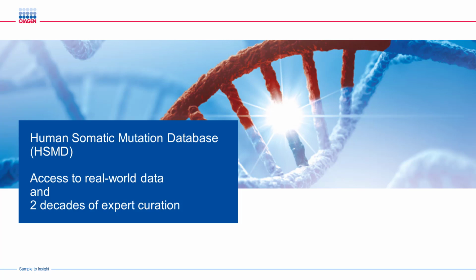Prior to joining QIAGEN, I was a variant scientist for over 5 years, and I would often feel like I was drowning in a tsunami of information. Some online databases attempt to house content, but unfortunately, the content is outdated or incomplete. So what if you could access a database that would allow you to find the answers that you're looking for faster?